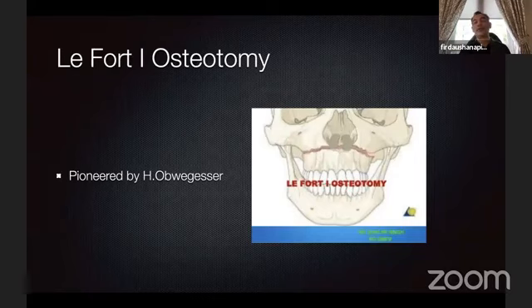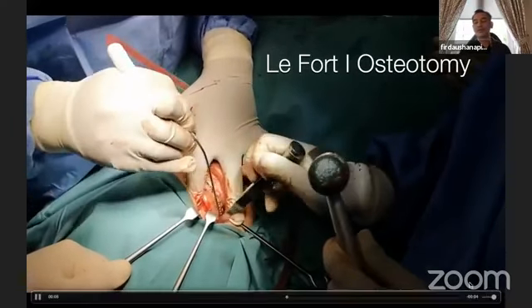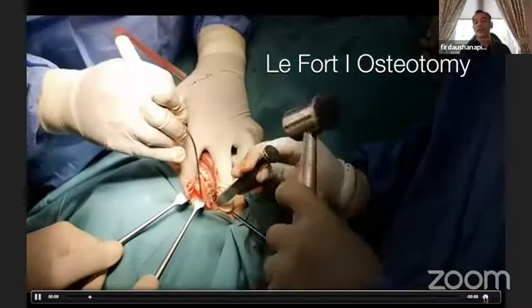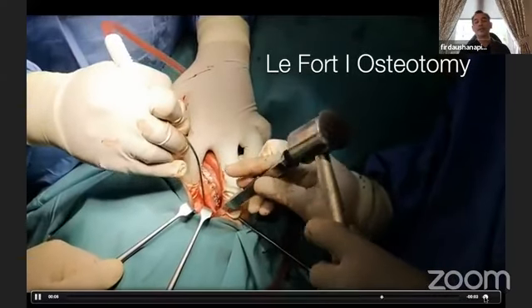So a LeFort 1 osteotomy is where we detach the maxilla from the base of the zygomatic bone and move it forward or back. So in this case, as you can see, this is part of the maxillary osteotomy. We are busy at work doing the osteotomy here.